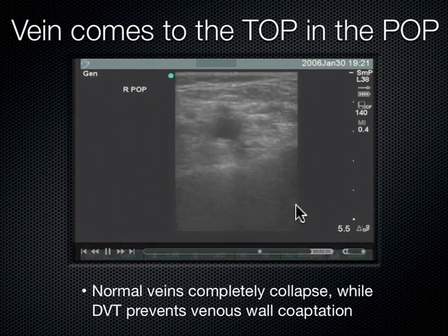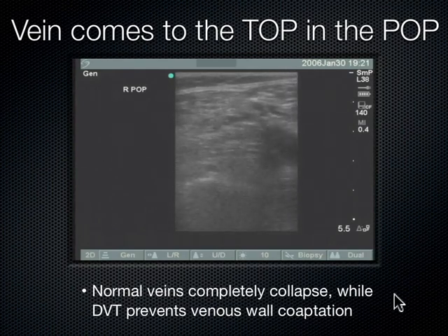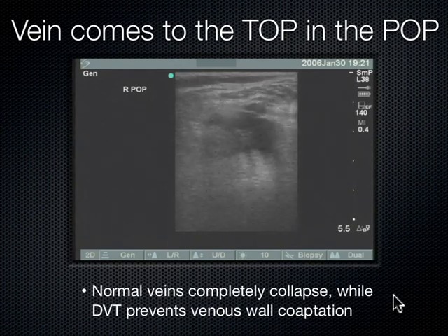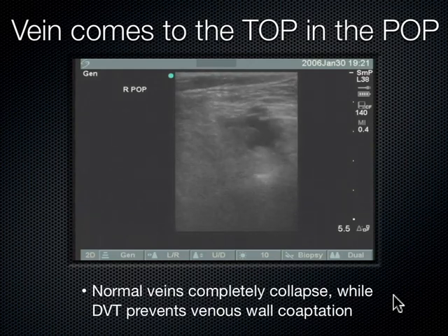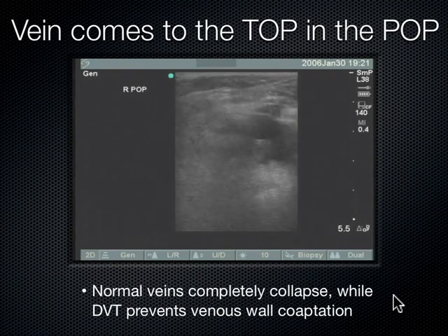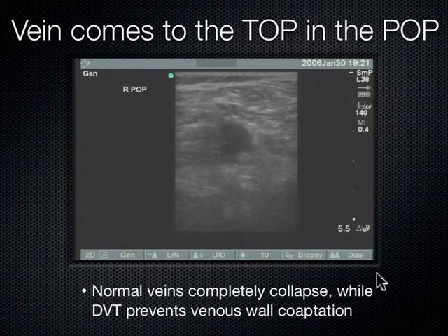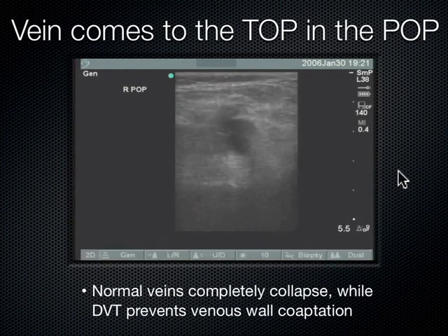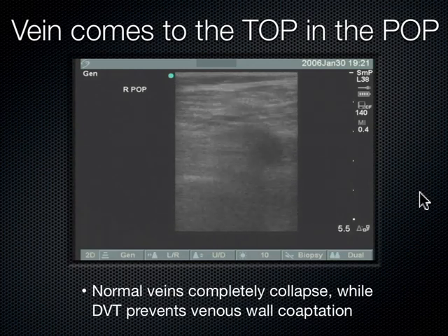Are we credentialed as a faculty group to formally read these? Everybody, I believe, is credentialed except for two of the attendings — the other ten of us are. So yes, the answer is yes. Now we're in the popliteal. This is what a normal looks like — here's the popliteal artery down here, and here's the popliteal vein up here. Again, if you're just standing there staring at it, it might not make sense. You've got to get in there, dig around, and compress it — then you'll see the structures winking back at you or not.